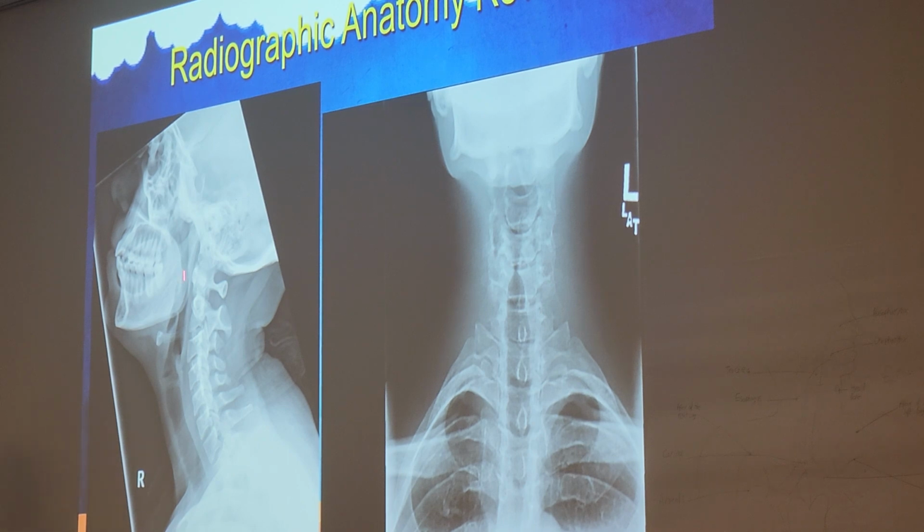So from that aspect, would you say it's pretty decent? I would say yes. But you mentioned that the neck is flexed, which we don't want. But what else? What else is wrong with that radiograph? It's practice for y'all's collimation evaluation class. And they don't have an anatomical marker. Thank you. We do have an artifact on the neck.